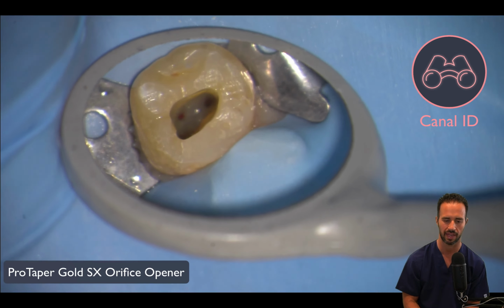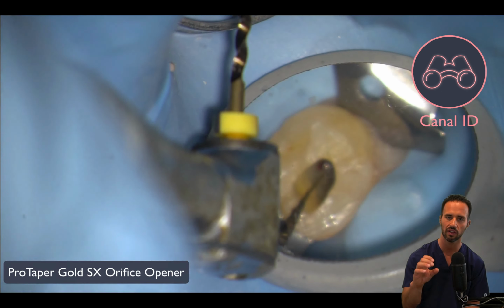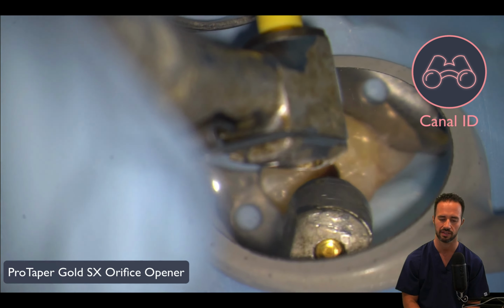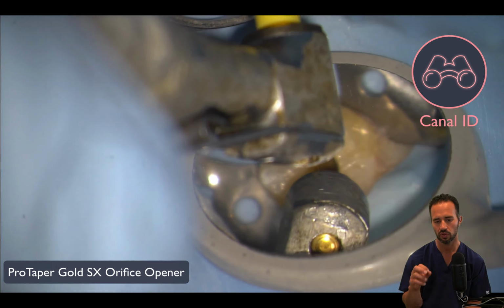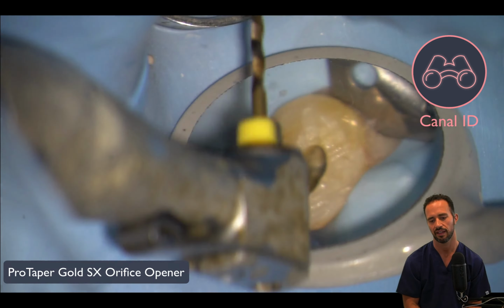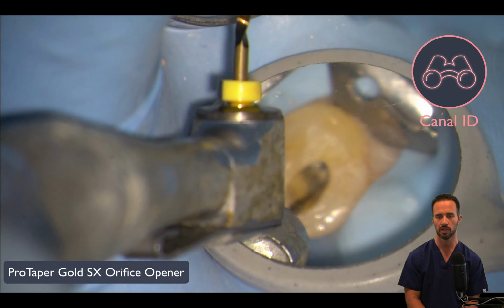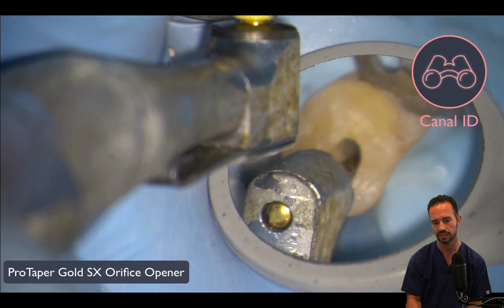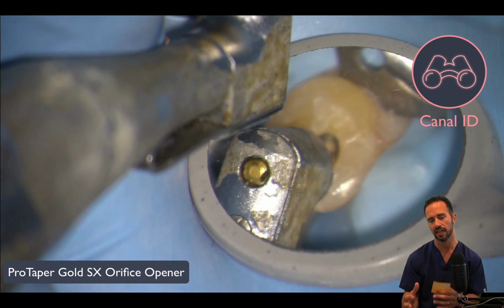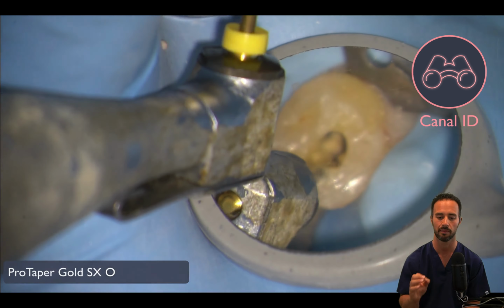So you can see that palatal canal at the top right edge of the access preparation now has far less pulp tissue, and it's bleeding a lot less generally within the entirety of the access prep. So our ProTaper Gold SX orifice opener is now being introduced into the distal buccal canal, and then eventually we'll introduce it right into our mesial buccal canal. But you can see this case was selected because it's a relatively straightforward case with some nice patent canals and an open chamber, and so these are the kinds of cases that are slam dunks.